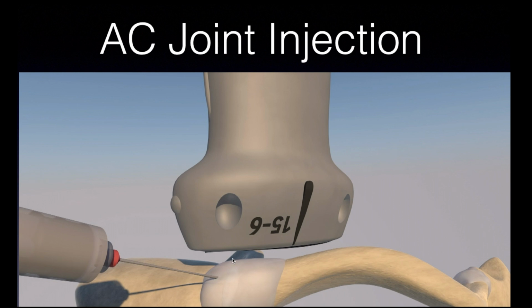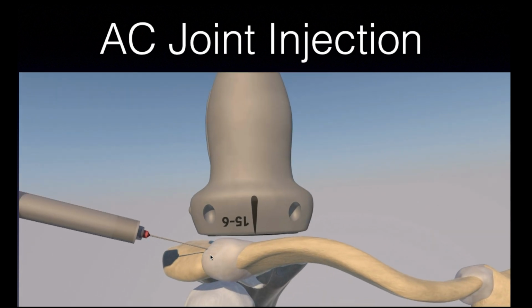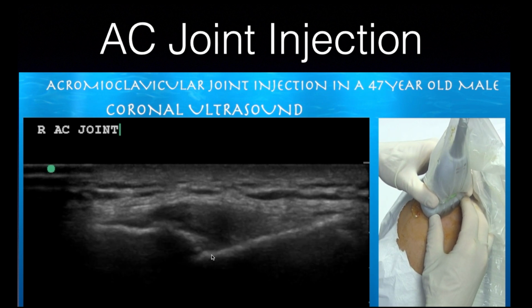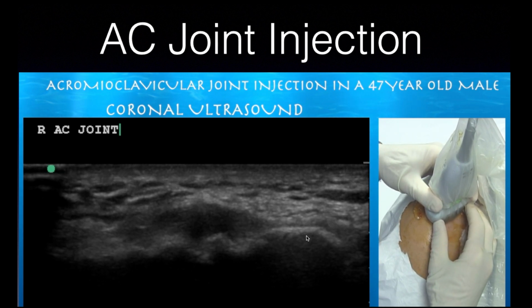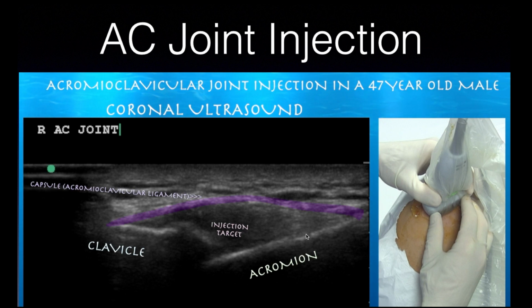Here was a case where I went in out of plane and then I thought I was in, but part of it didn't look like it was in, so then I changed in mid-procedure. I just pulled back on my needle and reorientated it, and then I went in plane. So that's not ideal either. I would probably just start from the in plane to begin with.